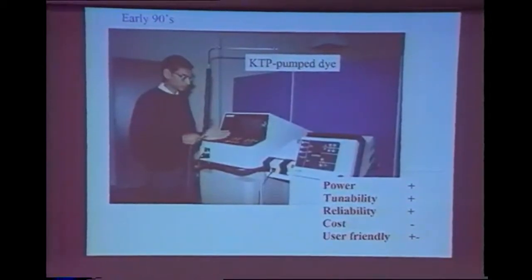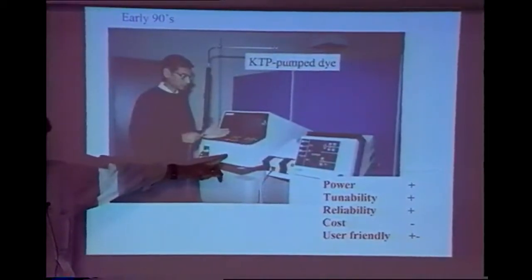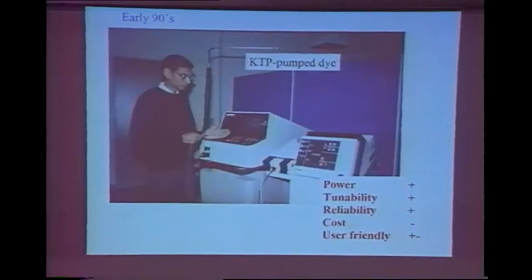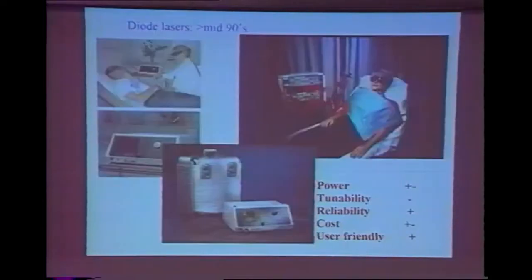The solid state part is pretty reliable, still very expensive, and so-so user-friendly. One of the advantages was that this could be used as a green laser by itself for surgery. And so different clinical groups could use this as a surgical laser and then connect it to the dye laser for PDT. We still use one of these, actually, that's now 15 years old, so pretty reliable. Although I have to admit we haven't tried to change the wavelength for years, so I still don't know how easy it really is to tune them.